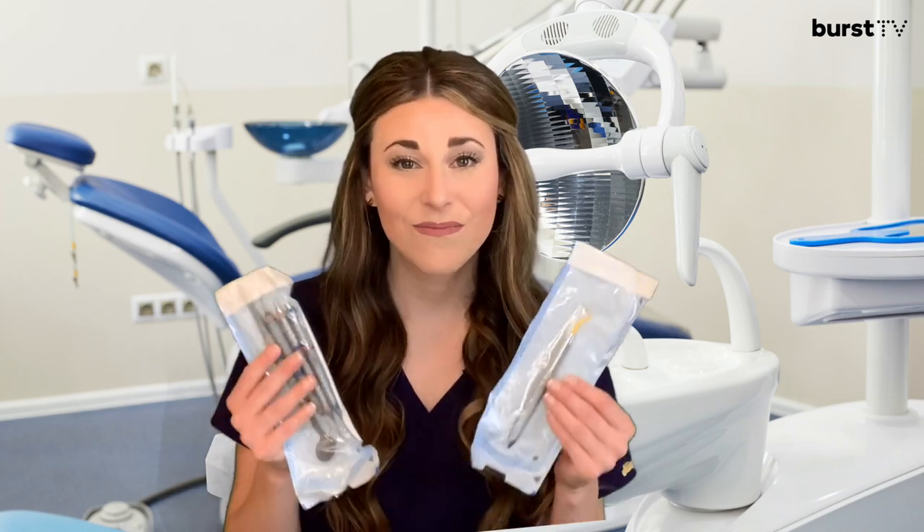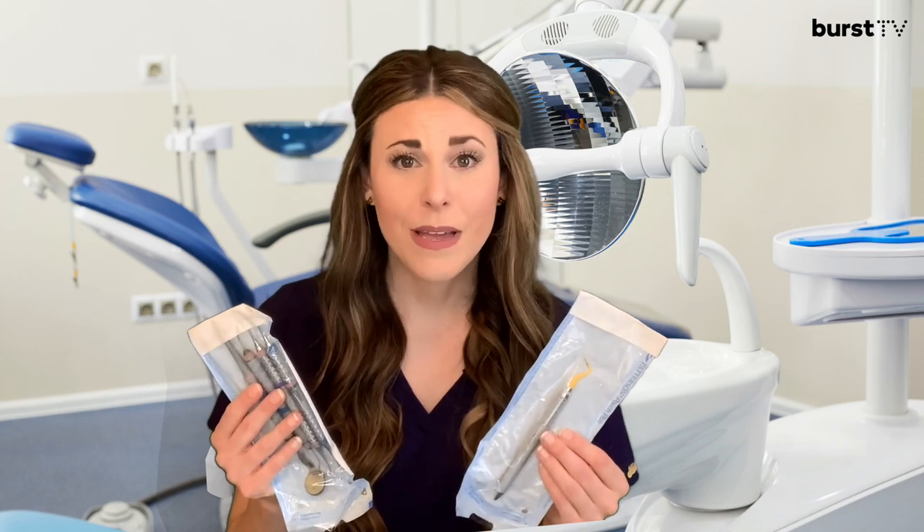When you show up to your dental appointment, the first thing you'll do is have a seat in an operatory, and you may see a tray of instruments that looks something like this. Your first thought may be, what are they going to do with those? Well, in today's segment, I hope to alleviate fear by reviewing some of the most common dental instruments in a hygiene kit.